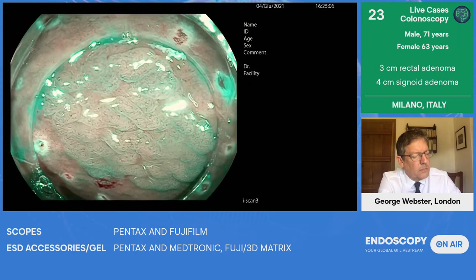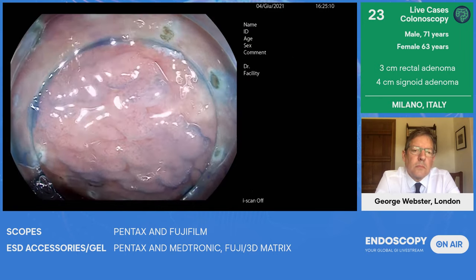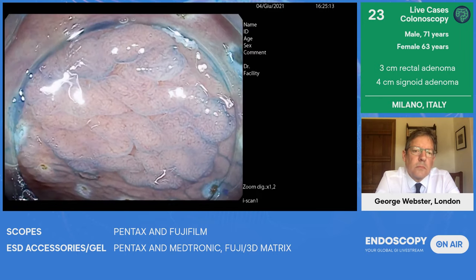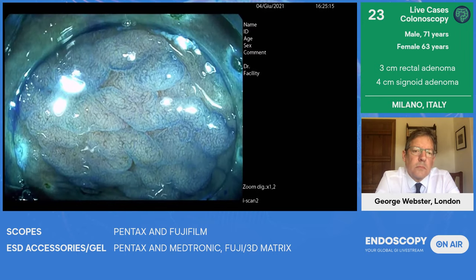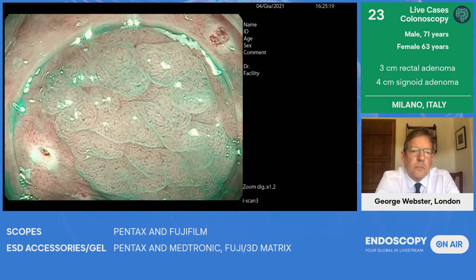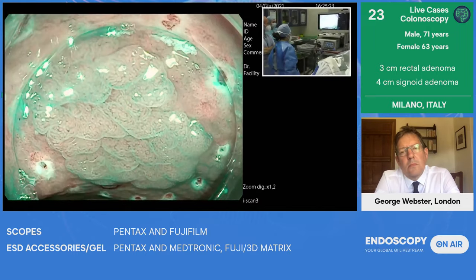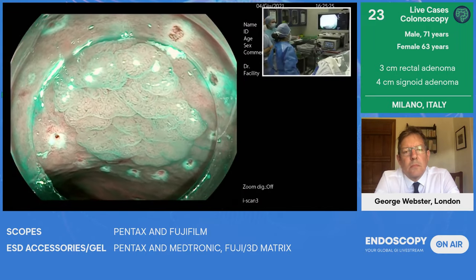I'm using the i-Scan 3 and also the optical enhancement. I'm showing you with the zoom, to have the enhancement of the glandular and vascular pattern. So it's not invasive, it's homogeneous. So it's a granular homogeneous type. It's not very big. And so we need to move forward.